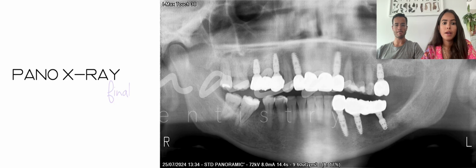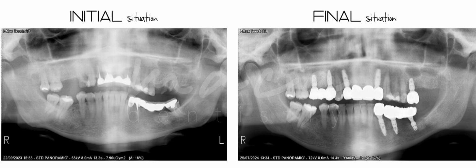Here the final panoramic X-ray. And finally the comparison between initial and final panoramic X-ray. I think that here as well it is possible to appreciate a great change in the oral condition of the patient.